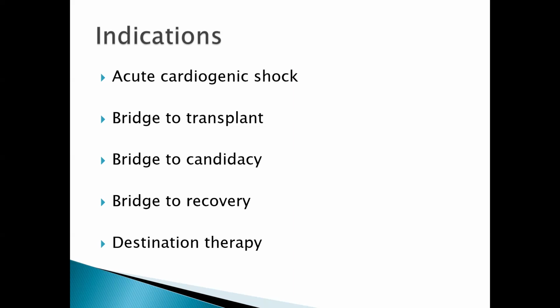Then it can also be used as a bridge to transplant. Bridge to transplant simply means that this patient already has end-stage heart failure and is on the transplant list. Perhaps there has not been a donor yet, but for this patient to stay alive, you have to place the patient on this device. So that is one of the indications: as a bridge to transplant. The patient is already on the list for transplant, but has not gotten a donor, and must be kept alive.